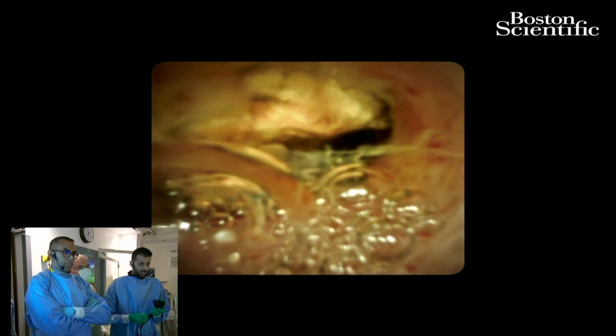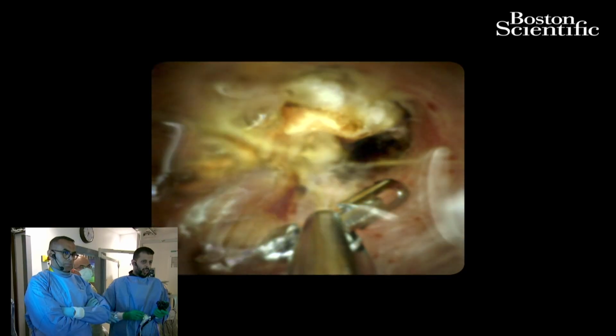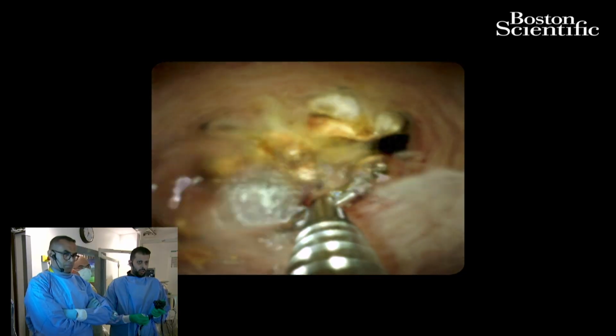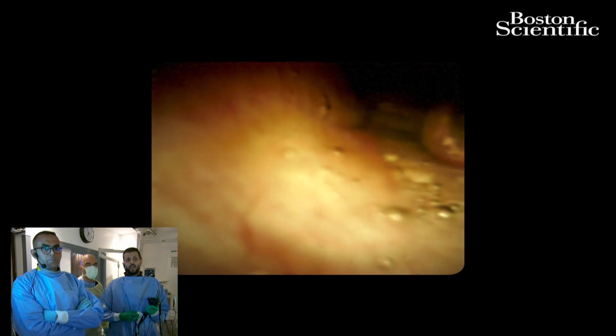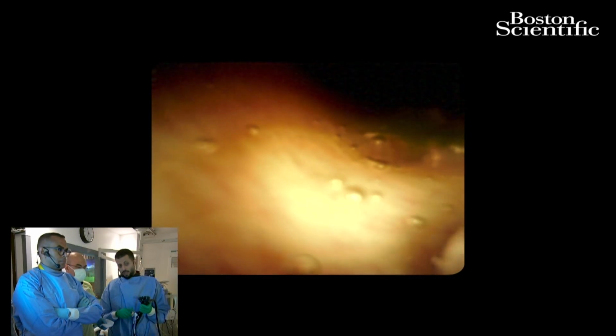However, as Dr. Adel said, if the patient comes for a conscious procedure, the wire is right there, we try to take at least a couple of brushes, and then depending on the stricture location, we decide on the next procedure, whether we go directly to SPY or EUS. If it's a distal stricture, sorry, go ahead, yeah.